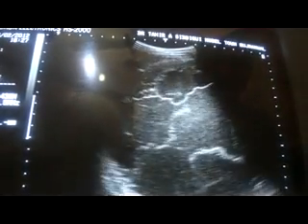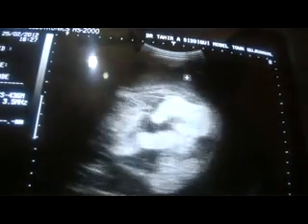This is the spleen. It is pushed superiorly and laterally as well by this well demarcated huge mass, seen up to the right iliac fossa.